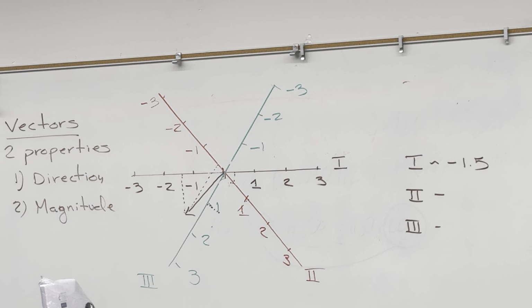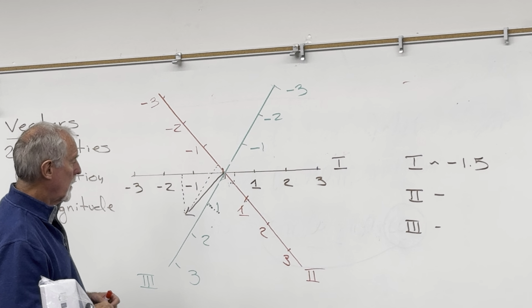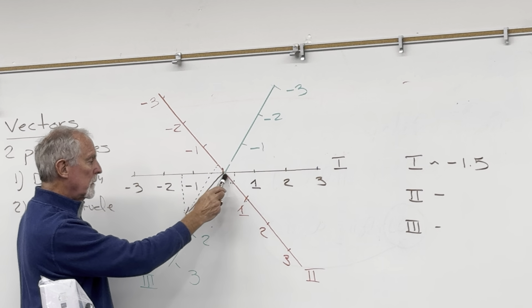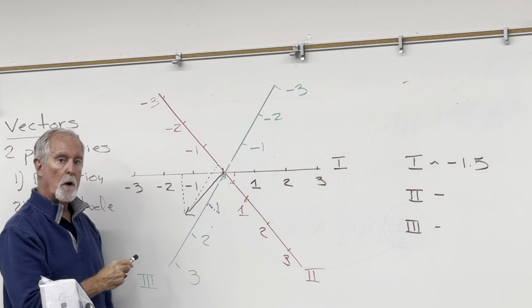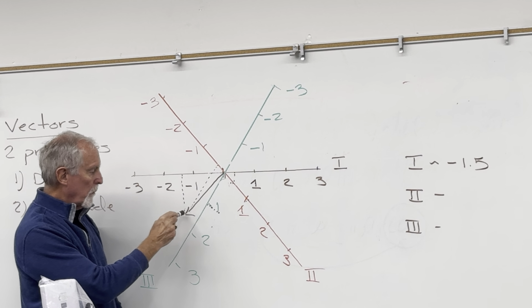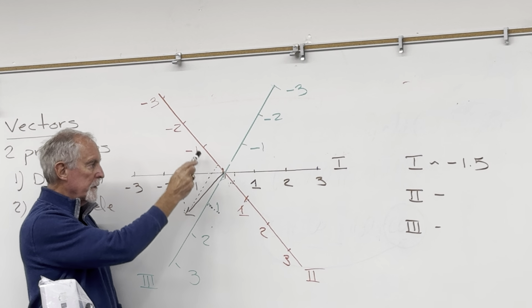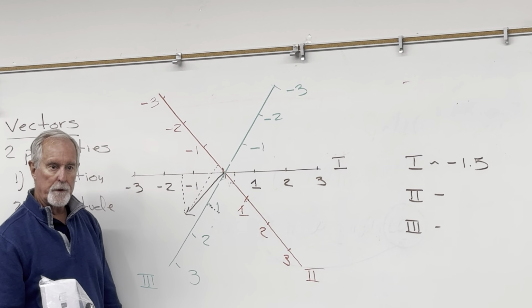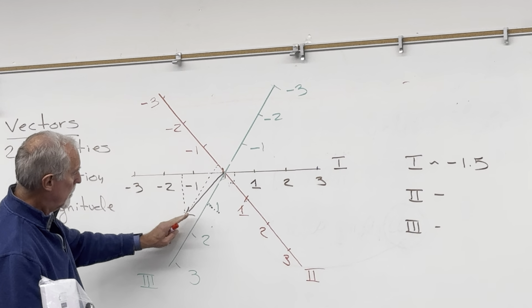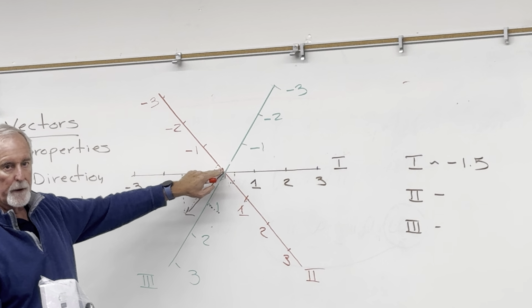You have a question? I don't get 2. Isn't the red already perpendicular with the tip of the arrow, I guess? To find out what type of deflection we're going to see in lead 2, we take this very end of the vector and we draw so it intersects any given axis perpendicularly. And so coming back to lead 2, the perpendicular intersection is right about there.